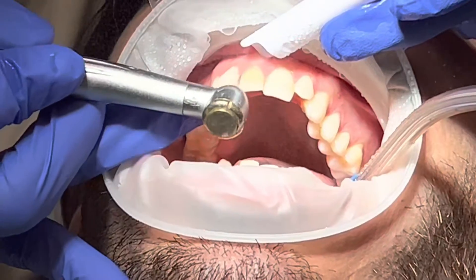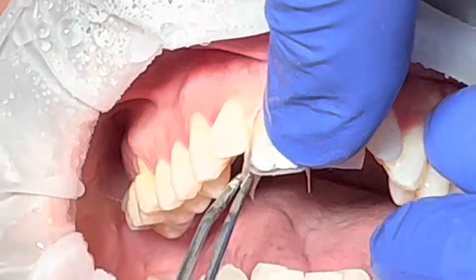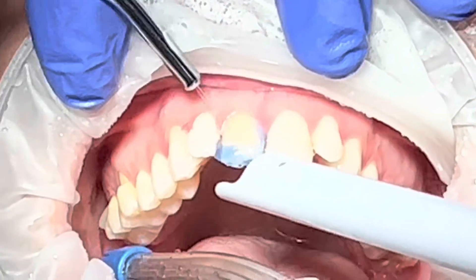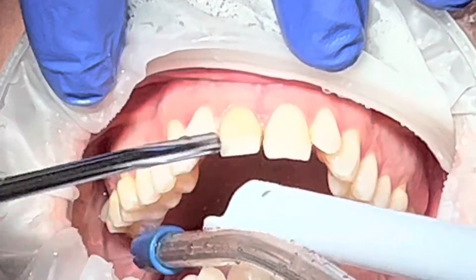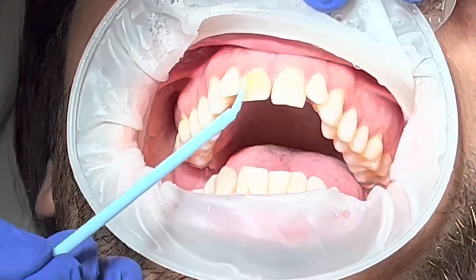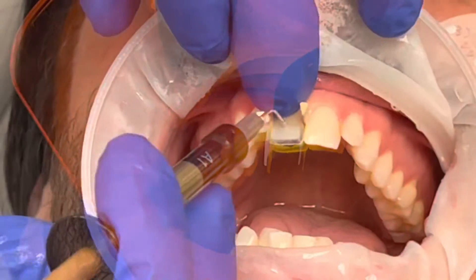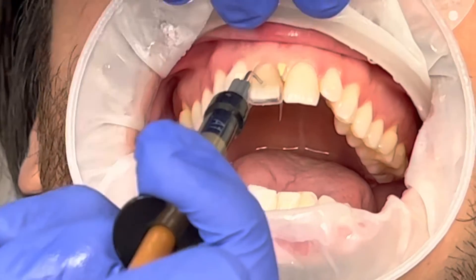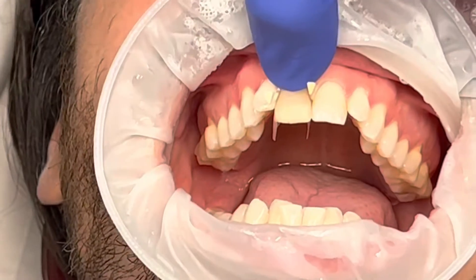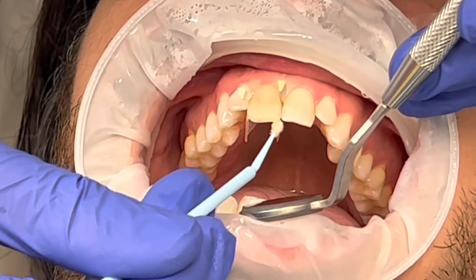My goal was to go ahead and remove all the stain that he had, which I did, and I also created a nice contact so I could try it on. But if you look at this picture, you can see the dark line right there — I didn't remove it. I wish I had removed that dark line. That is my main problem. This case didn't turn out perfect because of that black line — the connection between the old filling and the tooth structure. I wish I had removed it completely; it would have made a big difference.